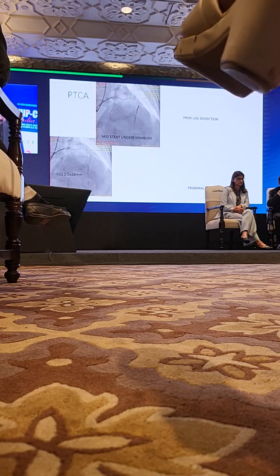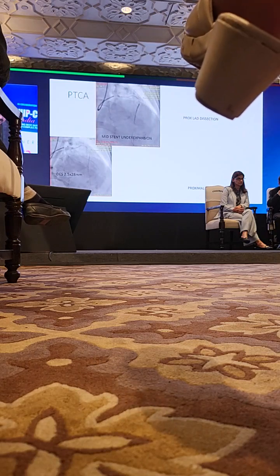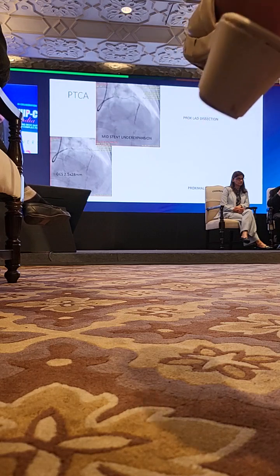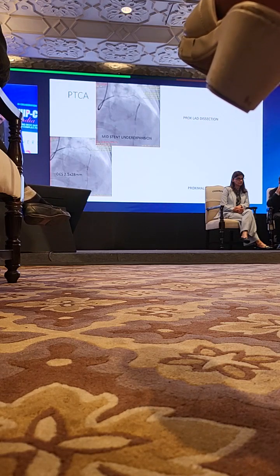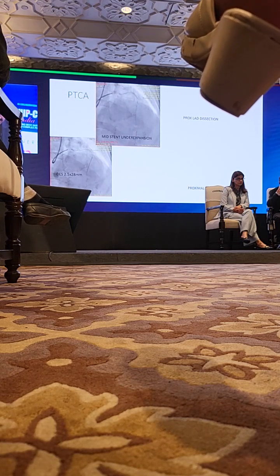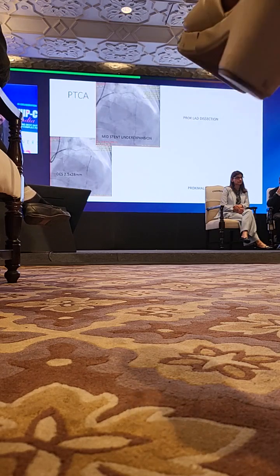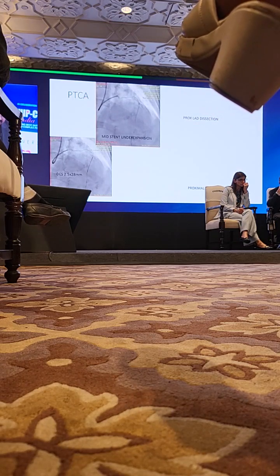And so after that, I thought of post-dilating it after the completion of the stenting from proximal to mid. Then I'll do the post-dilatation. That was the plan.